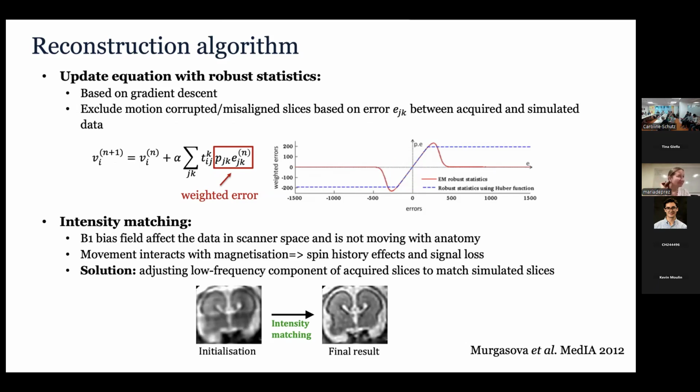I think pre-scan normalize might help, but this is a much bigger problem. It's not helpful. It's very close to the coil, I guess. Yeah, it's in the middle. A little bit helpful. Yeah. So I'm not really an expert on these things. It's just what I hear from around me.